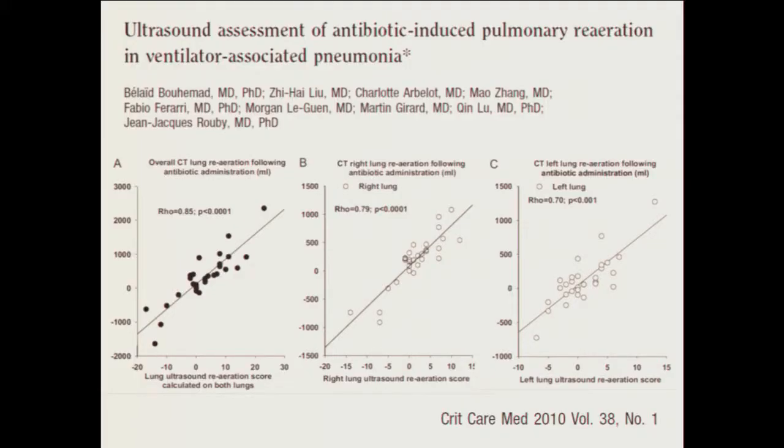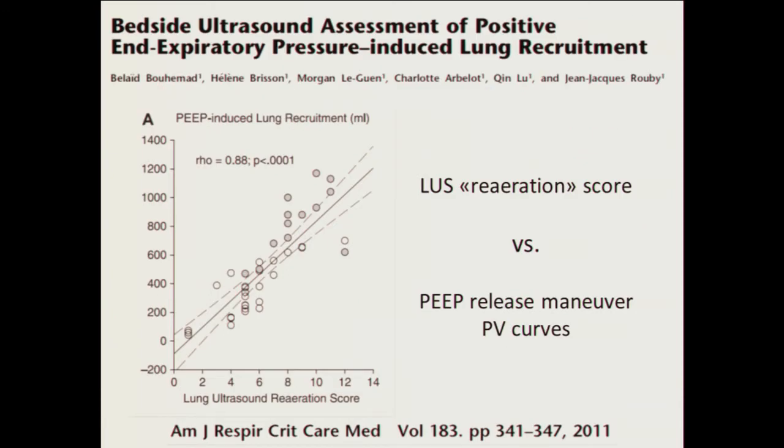This lung ultrasound score was successfully applied to assess the antibiotic-induced pulmonary reaeration in patients suffering from ventilator-associated pneumonia, and also the reaeration due to PEEP increase.